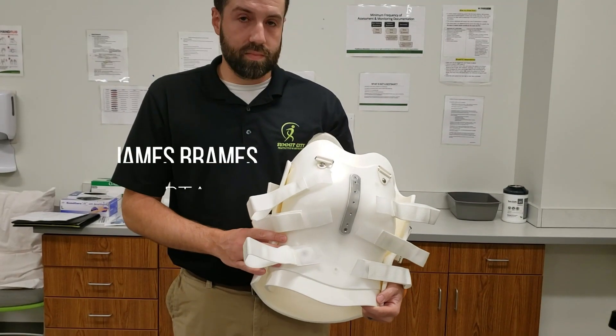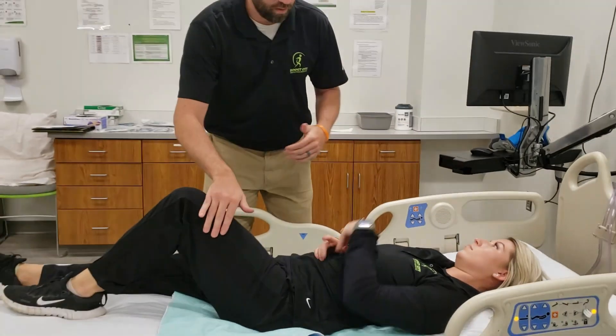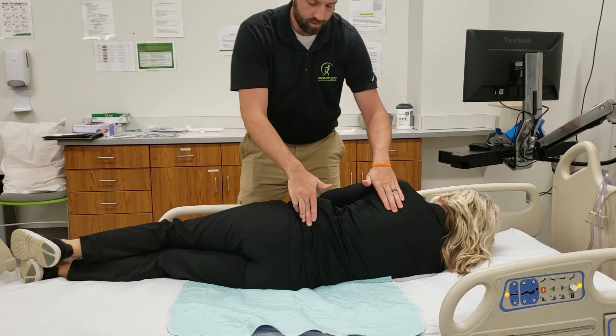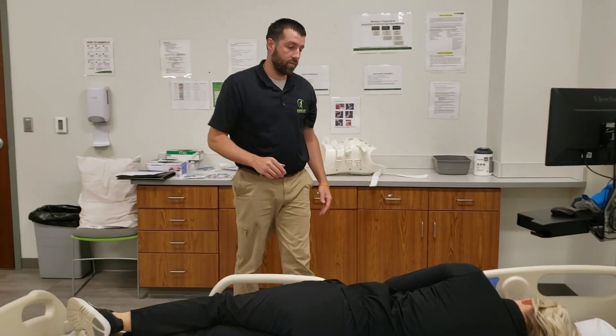Today we're going to be fitting a custom TLSO. We'll have the patient log roll towards me. To initiate, go ahead and bend your left leg. You'll reach with your left arm. At the same time, maintain the neutral spine all the way to the edge. Perfect. It is always beneficial to have more than one person whenever you're doing this.